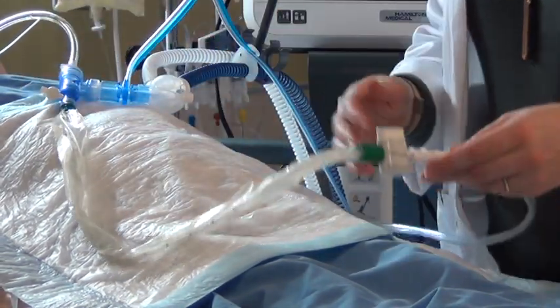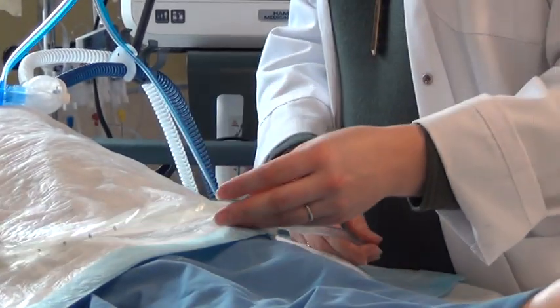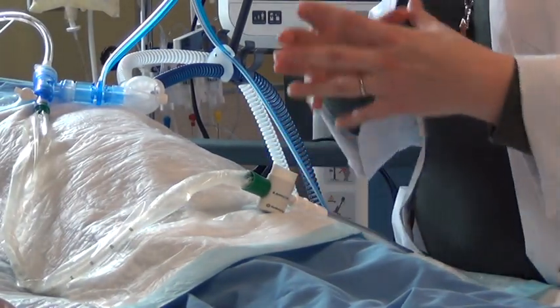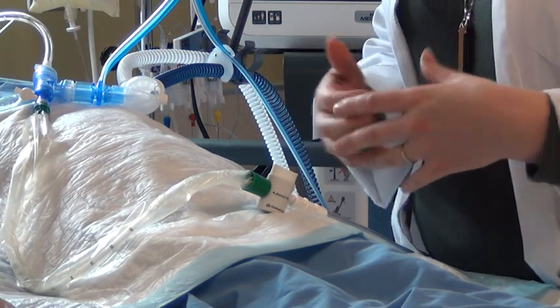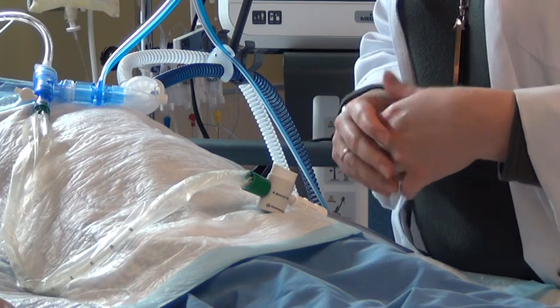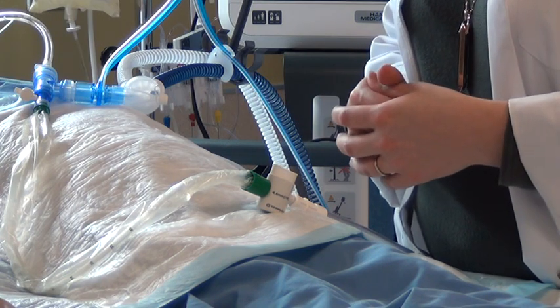Now there is a way, if ever an inline is not removing all the secretions that we would want, to use a sterile suction catheter as we would for anyone that has a tracheostomy on a medical surgical unit.